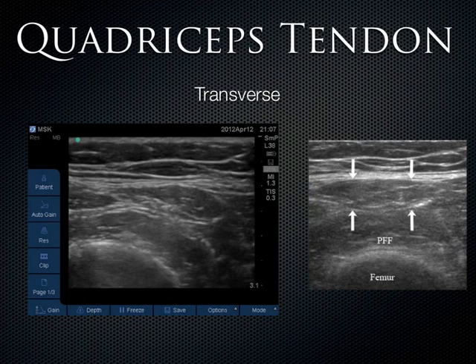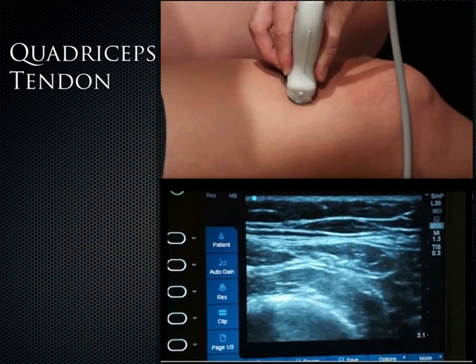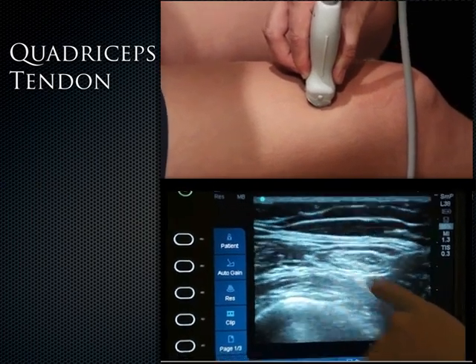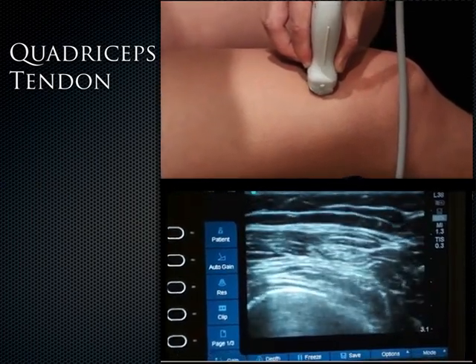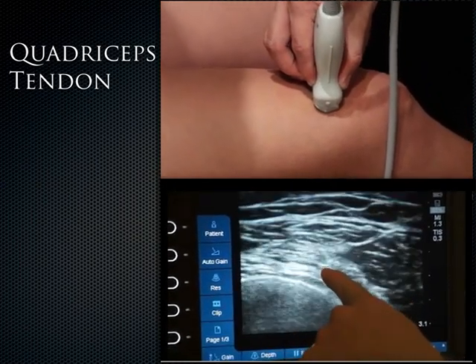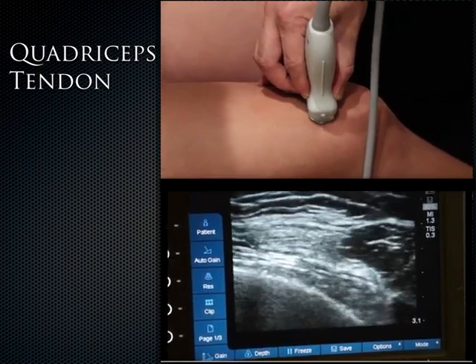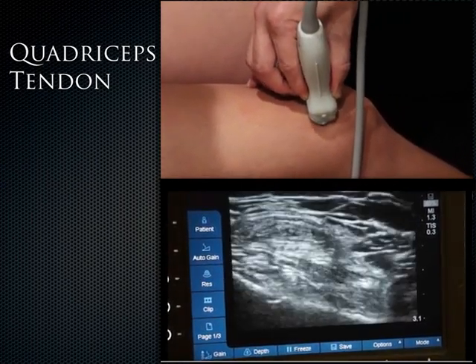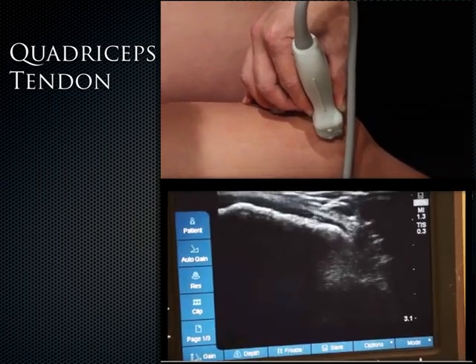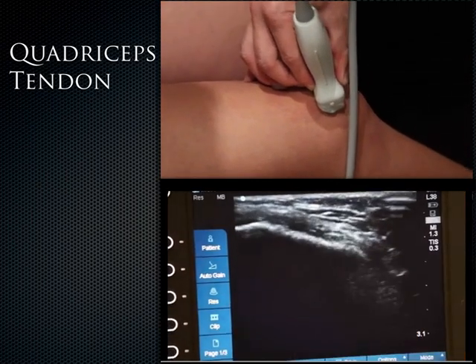Now Alan's going to show you how to do this in the short axis. So you can see that in the short axis, the quadriceps muscles will actually turn into the quadriceps tendon right here. And you can just follow that as it goes into the superior patella right here. You see that? Right there. And this is the patella right here.